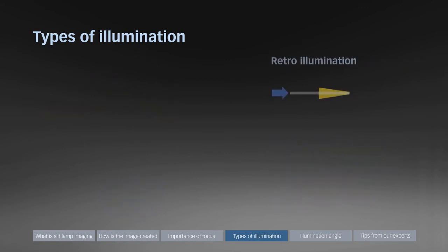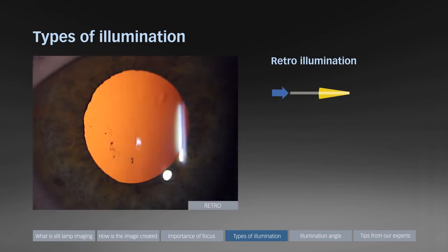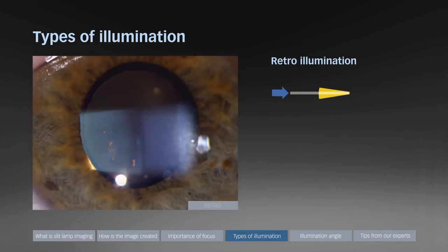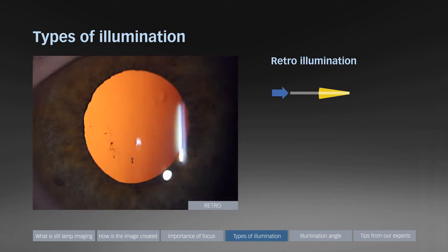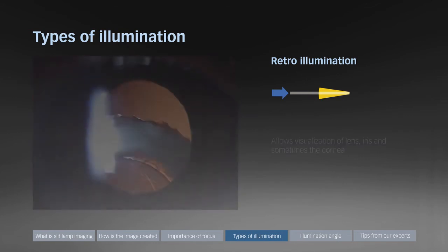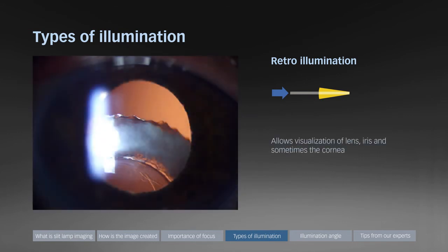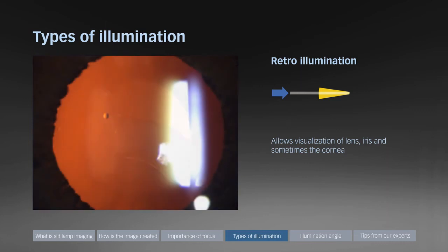Retro illumination uses light reflected from the retina coming towards the microscope. For comparison, the same eye with direct focal illumination and here again with retro illumination. This can allow excellent visualization of pathologies that occur in the lens, the iris, and sometimes the cornea.